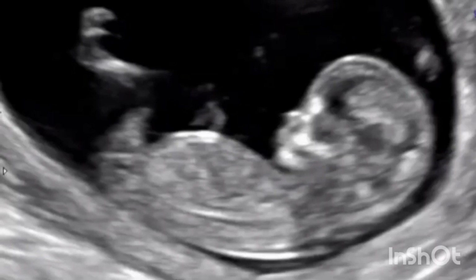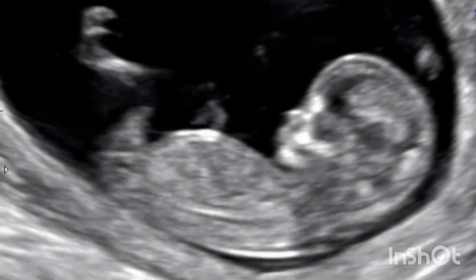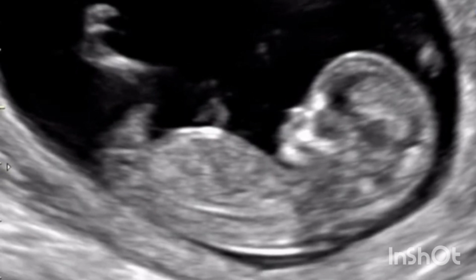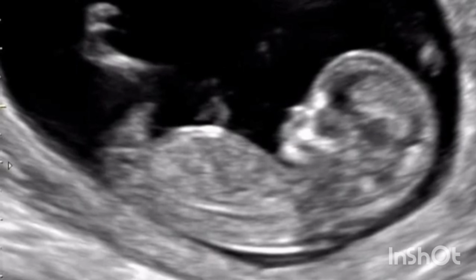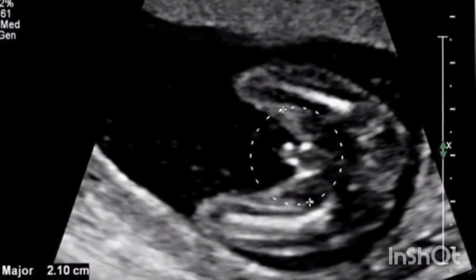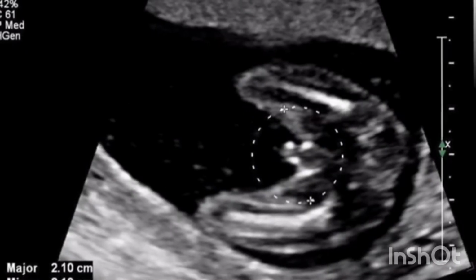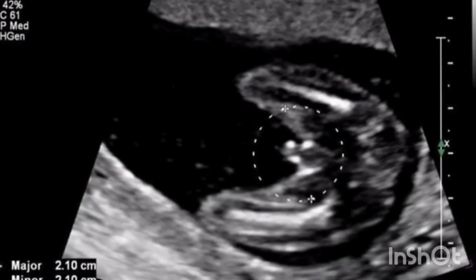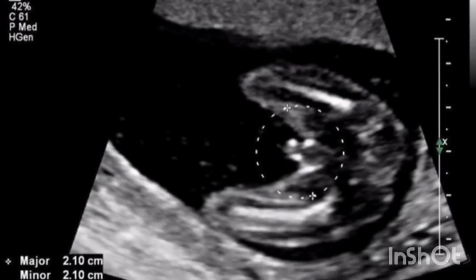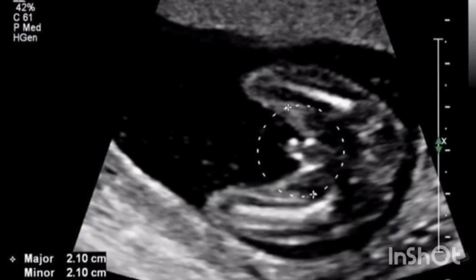If the baby is in a cephalic position, at the pubic region of the mother, scan through the fetal head, abdomen, then to the buttock of the baby to the thigh. At this level of the thigh is where you calculate the femur length for dating. Then slightly manipulate the transducer from sagittal to transverse position at the level of the buttock to get across the two thighs. In between the thighs, we get the sex of the baby clearly. Quite easy, right?